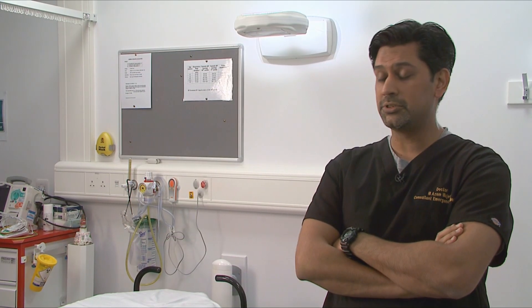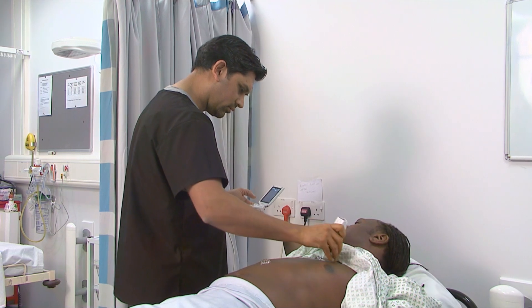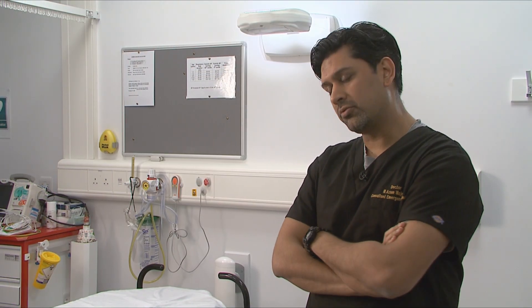We see about five to six traumas a day here, and having this machine in hand I can use it as an initial screening tool for free fluid in the abdomen, for pericardial effusion, and with the vascular probe I can use it for different blocks in the legs — the femoral nerve or fascia iliaca blocks.